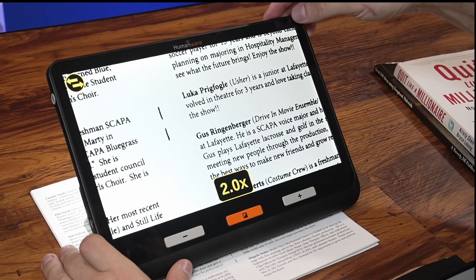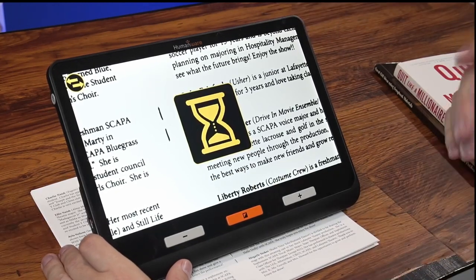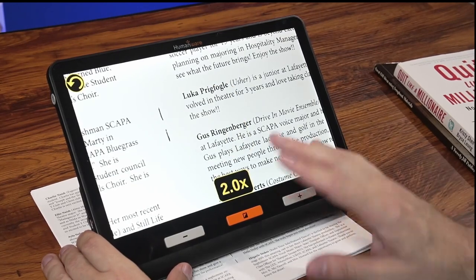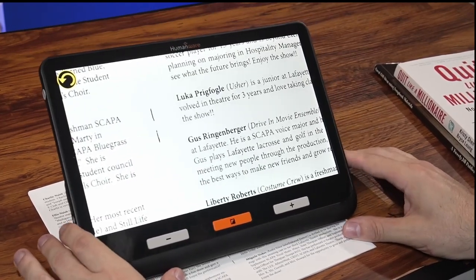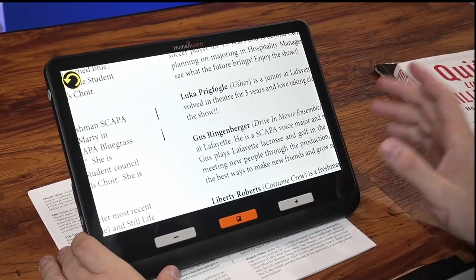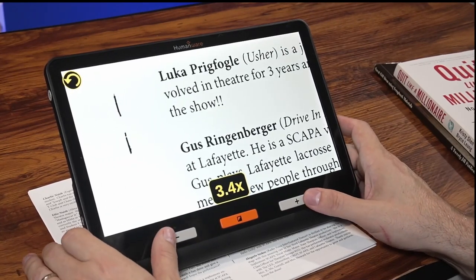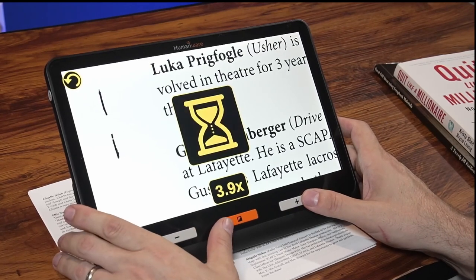There's a camera button in the top right corner. If I click it, it will process and take a photo — just a screenshot — and gives a little vibration to let you know it happened. Now if I move the device around, the image stays locked on screen and we can still zoom in, zoom out, and change color options.